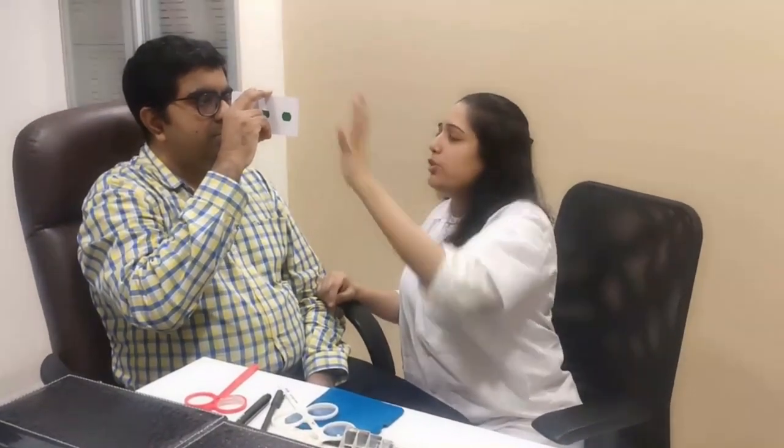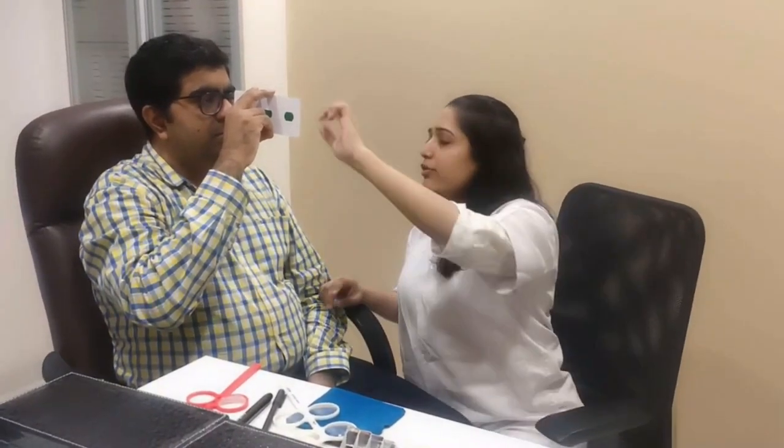Don't switch your eyes between red and green. You are supposed to see both the lines together. Keep looking at the barrel till the red and green fuse and become one. Keep on fusing it as long as possible. You have to do this exercise for at least 5 minutes a day, minimum 2 times.